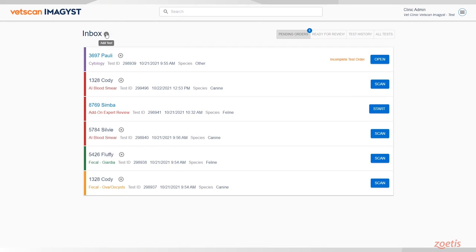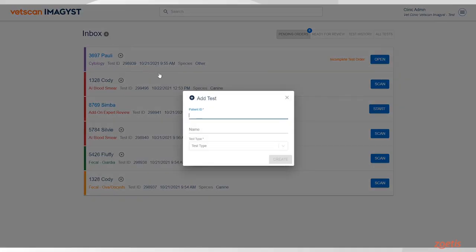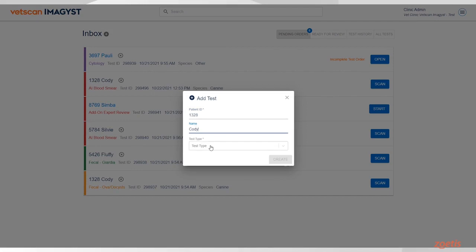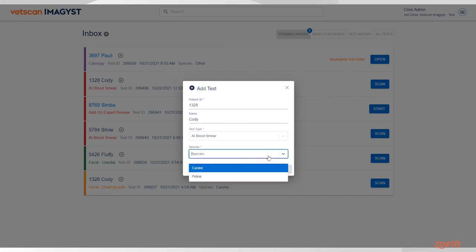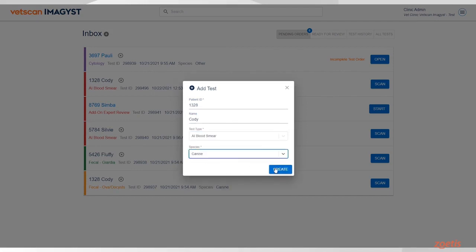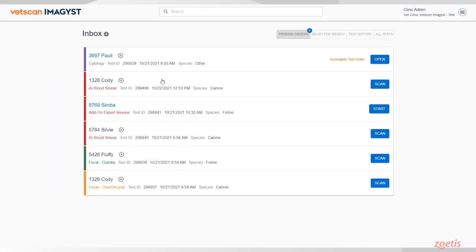Sample information will come pre-populated from any FUSE connected software system. If no integration is available, select the Add Test icon, enter the required information and select Create, then select Scan for the correct sample.